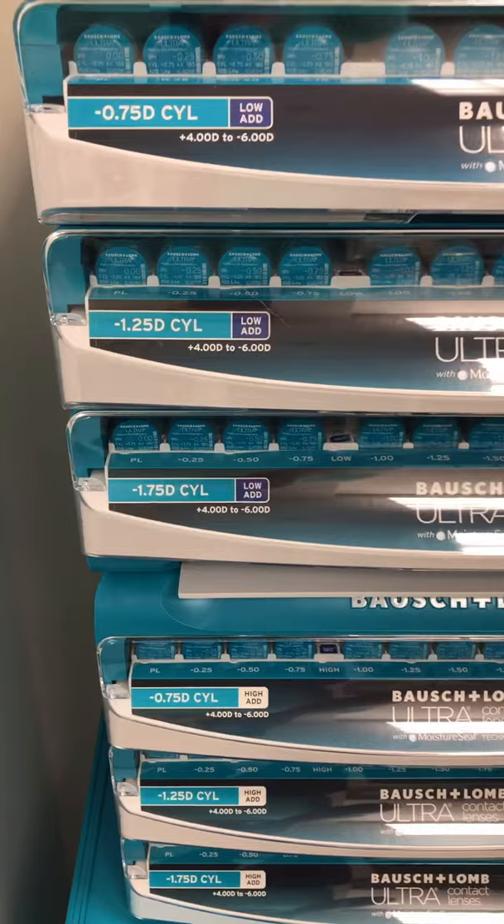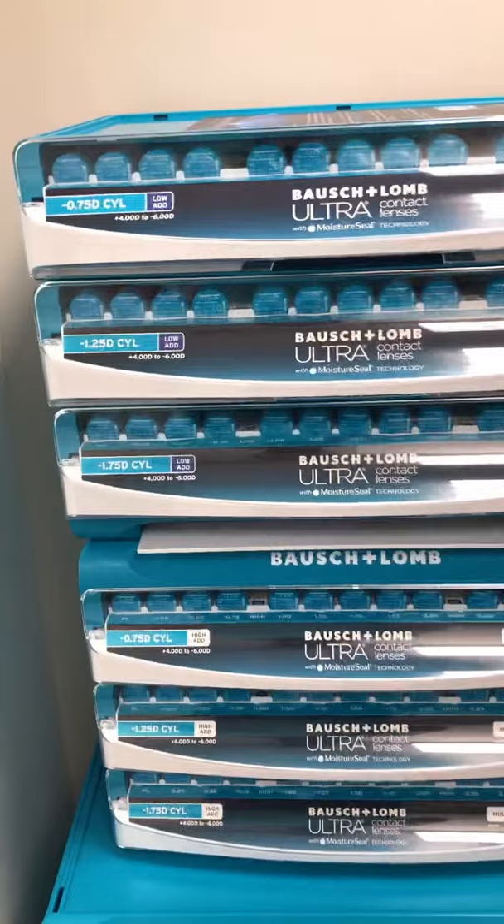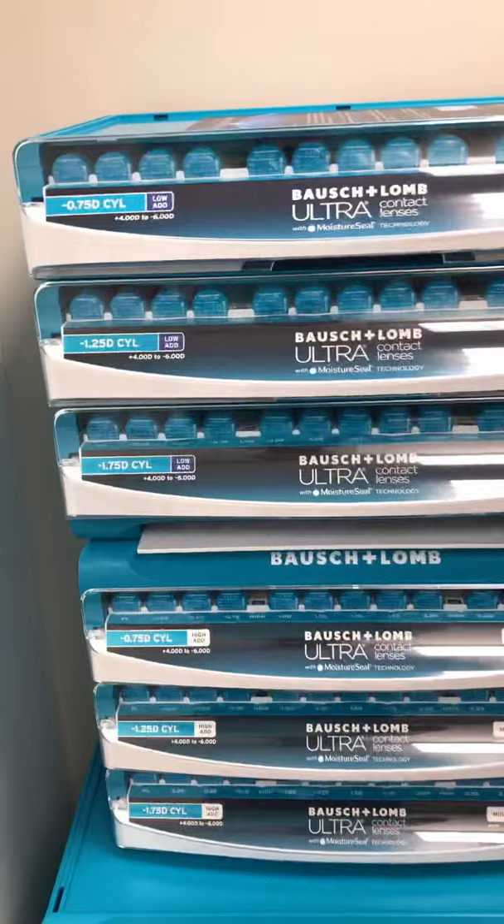What's really exciting about this set is it comes with — well, first and foremost, it's in my office, which is awesome. This is our contact lens room, as you can see — space to get ready and put them in and take them out. Each of these cabinets contains contacts, and we have three-quarter cylinder, 1.25 cylinder, and 1.75 cylinder, with a low and high add power.